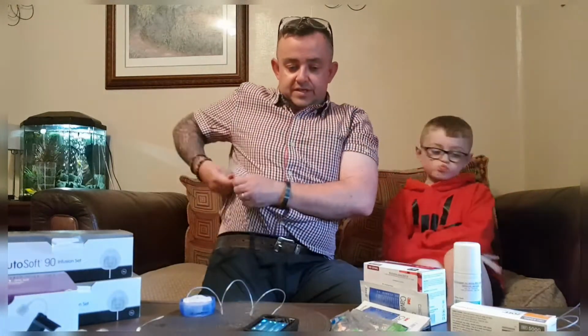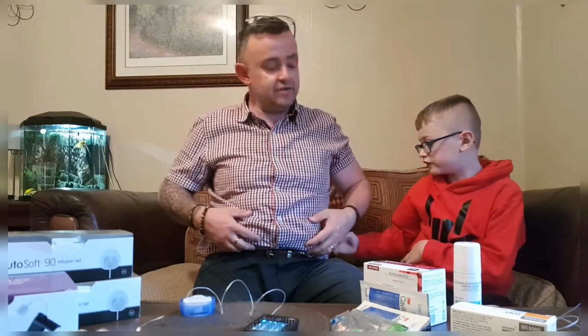I need to choose my next site. Now I don't use around here, as you can see. Since becoming diabetic and doing injections, a lot of this is due to insulin. I have lipodystrophy. I can never say that word on any of my videos. So I don't use the front. It's painful when I inject in it, and also the absorption rate, so we don't use there.